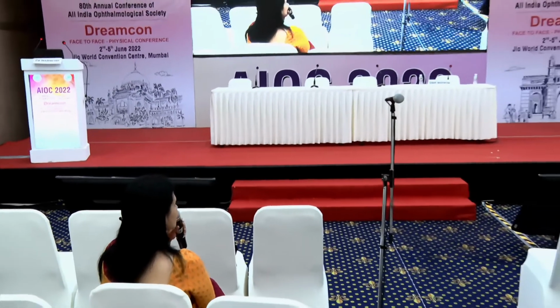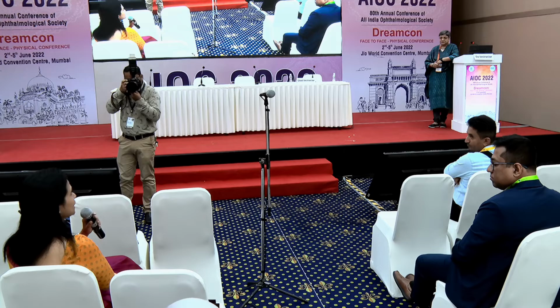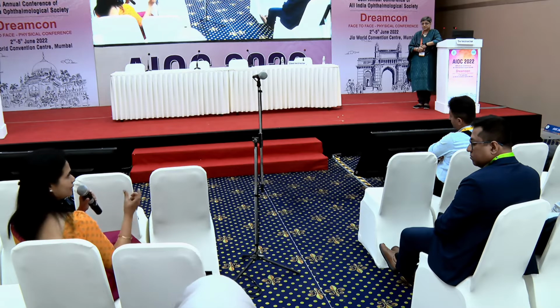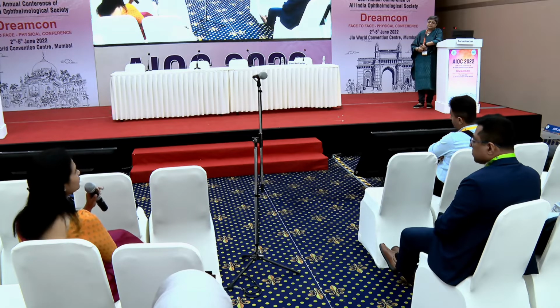So many times this is a question that is asked: can we do a UBM in the clinic, and necessarily should we do it under examination under anesthesia? Not necessary. In fact, many of these children, you can pacify them, especially when they are sleepy. We don't use a speculum. We take the mother's help to open the lids, because sometimes the minute you put a speculum, they can be squeezing and screaming. So with the help of just separating the eyelids, and of course we use the automated water bath that is available, the disposable one, we should be able to get those images. So even if you get 1 or 2 clear images, we should be able to understand what the condition is.